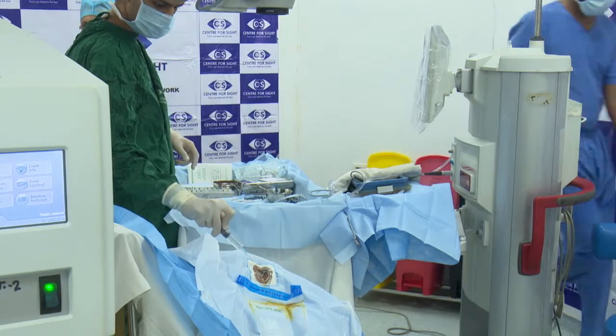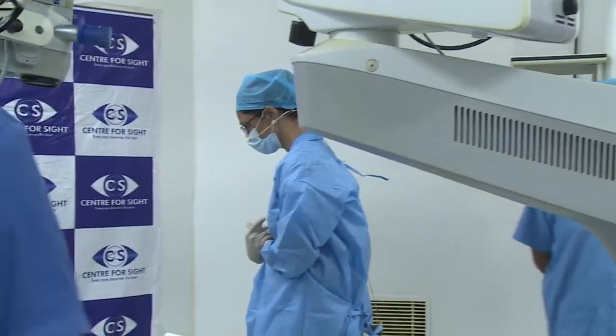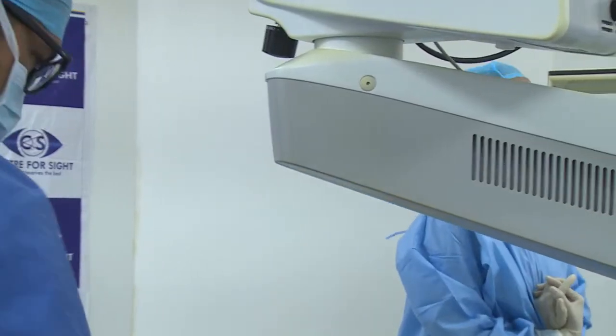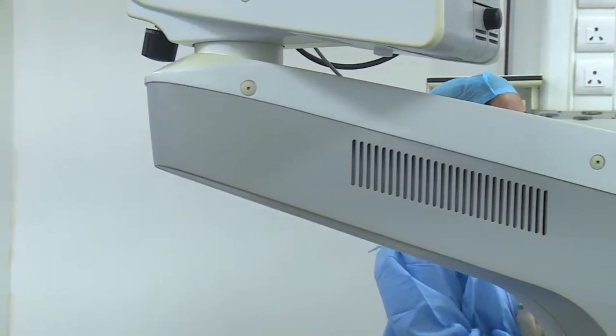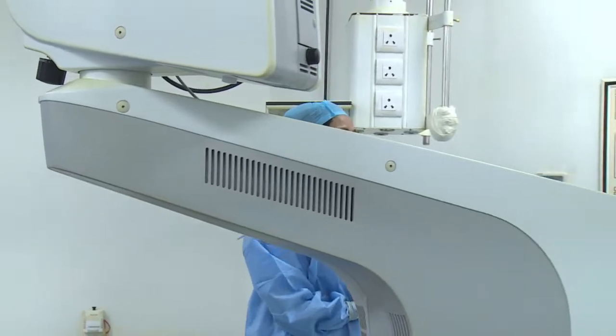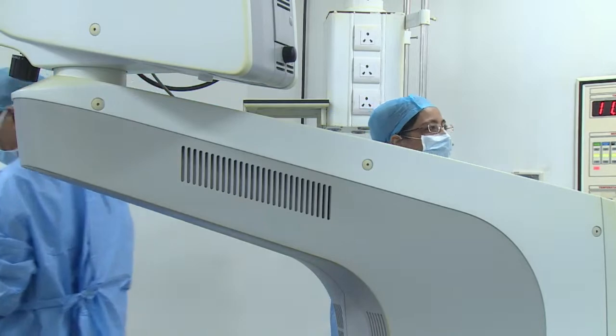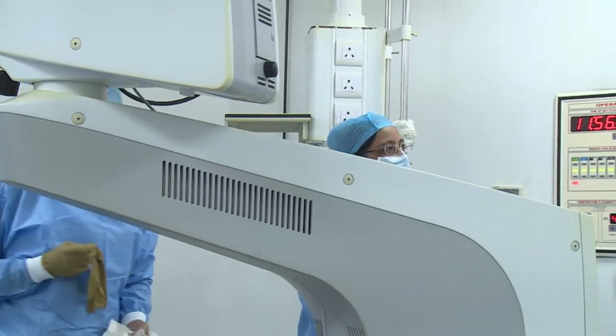Yes, sir. With femto rexis, we just make sure that it's 360-degree covered with the rexis. And that I make sure. And if the visco removal is complete even behind the IOL, then the alignment of the lens can be checked that way.